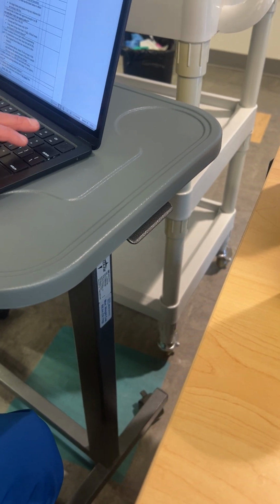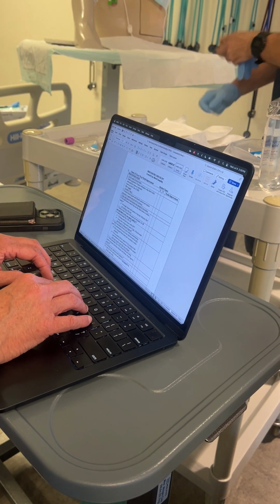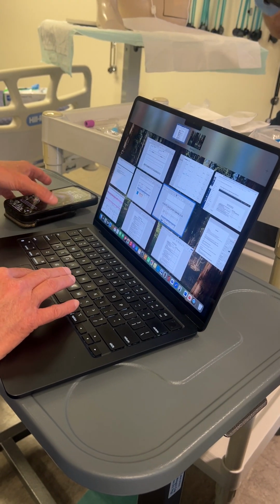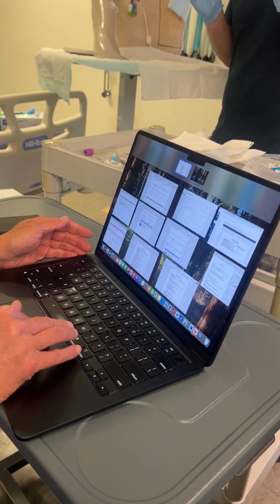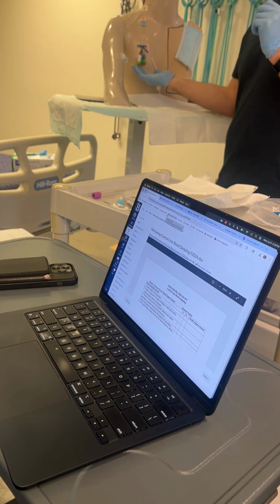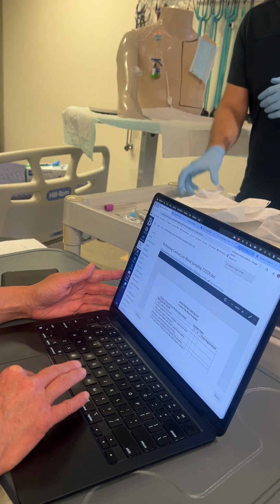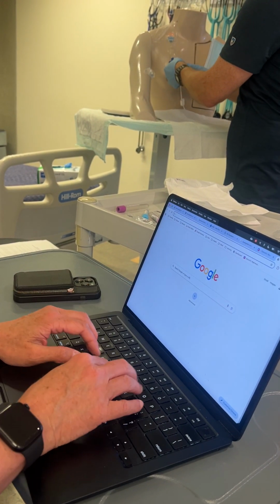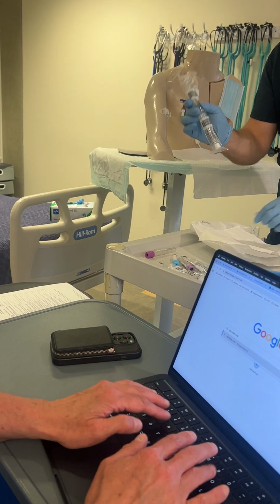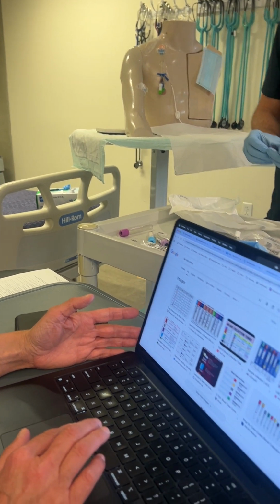Okay, so walk into the room, I'm still in the room, perform my hand hygiene. One of the things we didn't do, right? Can somebody think that, so we changed our dressing, what do we not do? Change the caps, because we're drawing blood, right? So this would be a good opportunity if we needed to change those caps. Also, oftentimes, when I say just the cap too, it's often change the hubs, right?